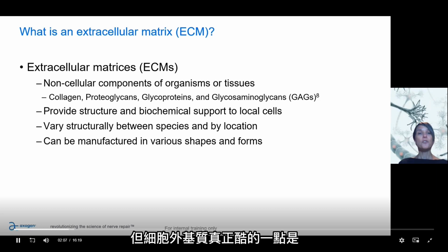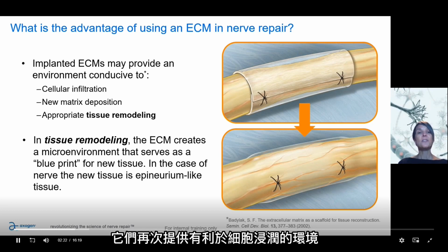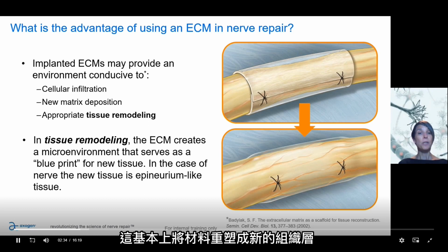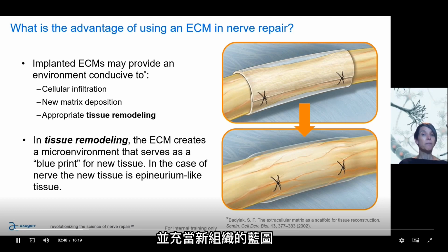But the really cool thing about extracellular matrices is they can be manufactured into various shapes and forms. Again, they provide an environment that's conducive to cellular infiltration, which allows the patient's own cells to lay down the new matrix and basically remodel that material into a new tissue layer. You can think of the extracellular matrix as serving as a blueprint for new tissue. It tells the body where to lay down that new tissue. And in the case of the nerve, that new tissue is an epineurium-like tissue.